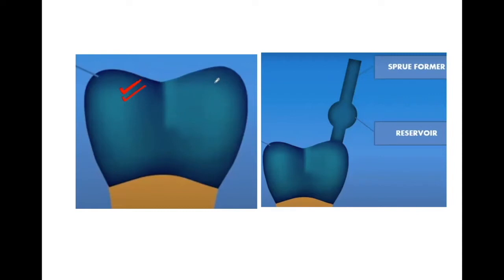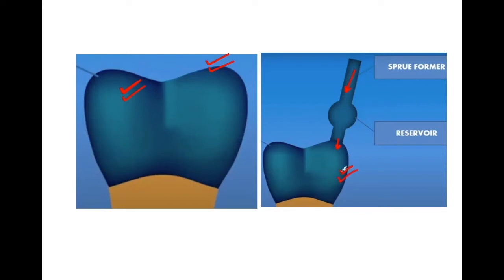This wax pattern is ready with us; this form we want as our final restoration. The next step is the sprueing of the wax pattern. This is the sprue former — it's a hollow channel which is attached to the wax pattern. Basically, it provides a channel so that molten metal can flow into this area, which will be hollowed after we remove this wax pattern by keeping it in the oven. We make the wax pattern and then attach the sprue former, which is a channel for the molten metal.